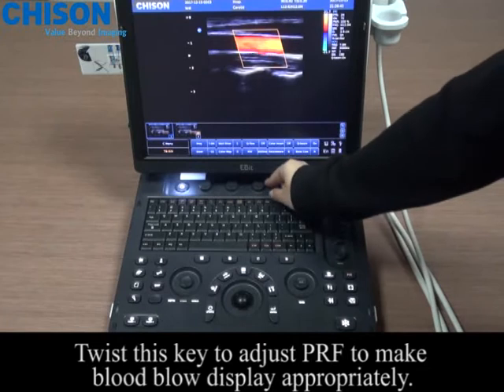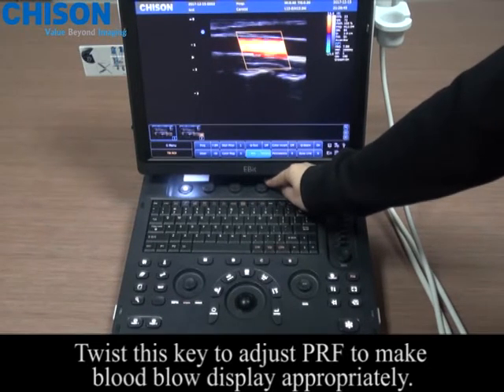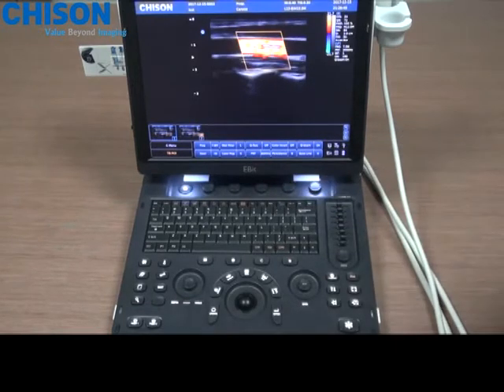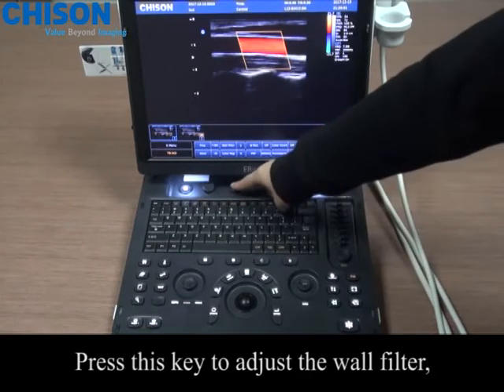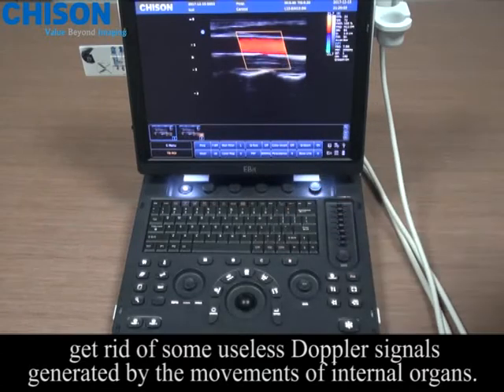Twist this key to adjust the PRF to make blood flow display appropriately. Press this key to adjust the wall filter. Get rid of some useless Doppler signals generated by the movements of internal organs.